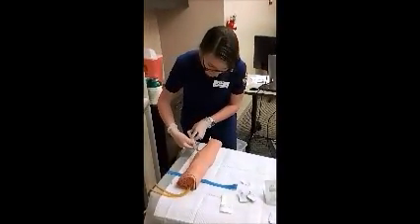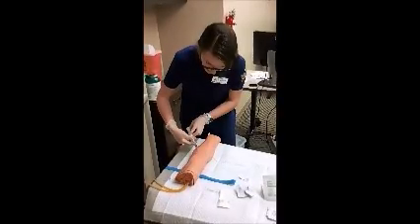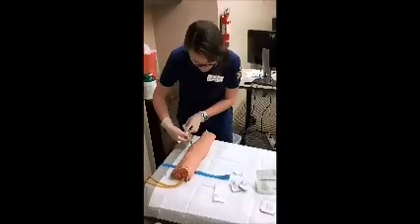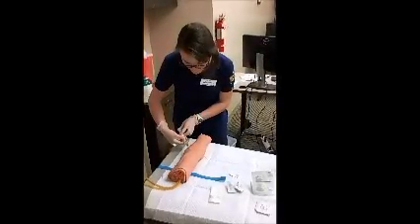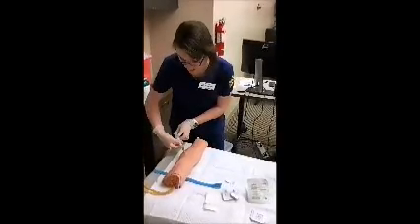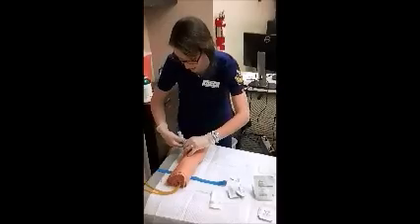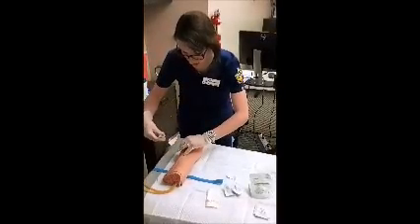We're going to slowly inject about 5 milliliters of this solution. Do it real slow, and we're also going to keep monitoring our IV site for any signs of infiltration while we're doing this. Okay. Once we hit about 5 milliliters, we can undo our saline lock.